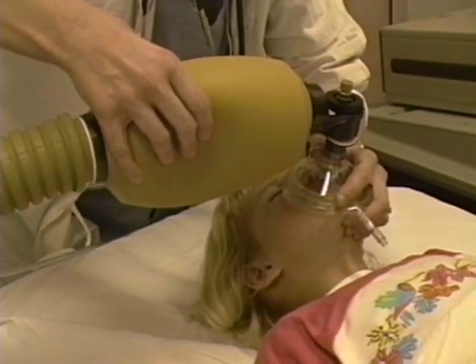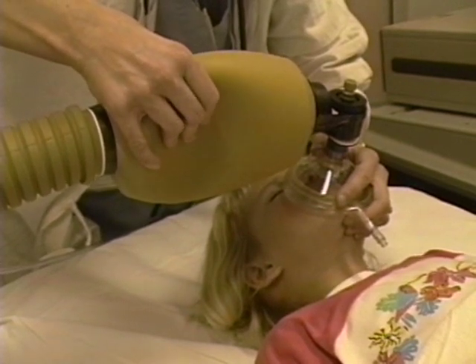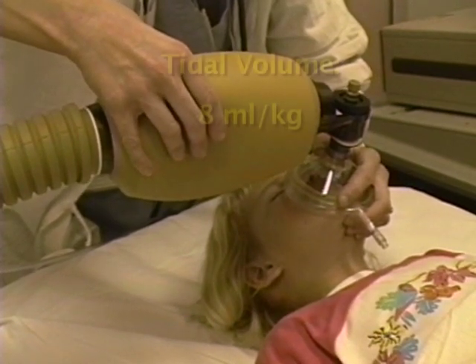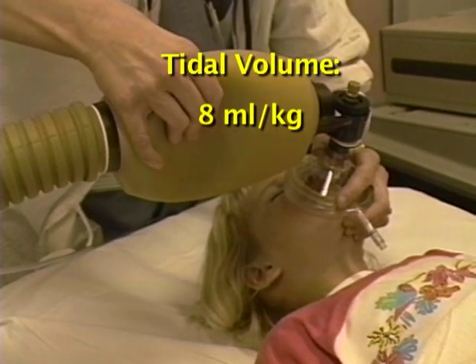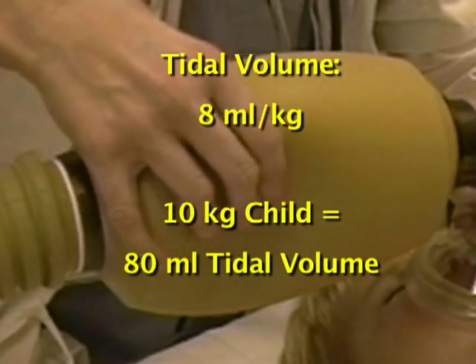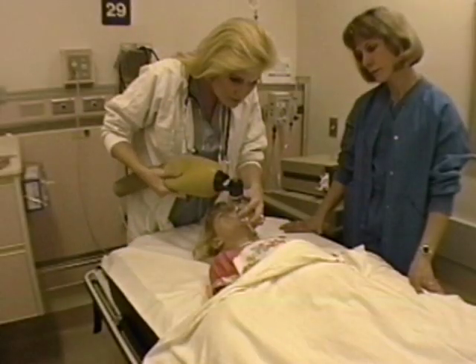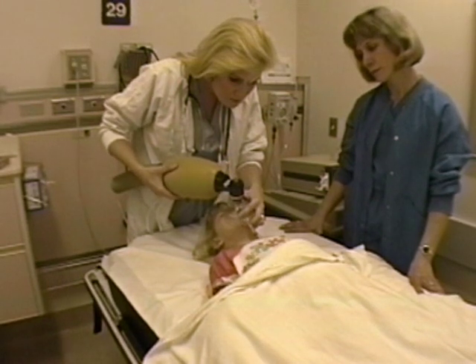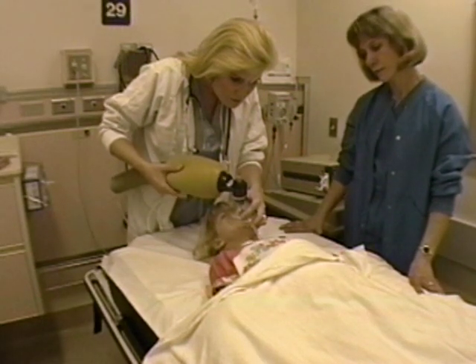To ventilate, squeeze the bag. The chest should rise with each breath. Both children and adults have a tidal volume of about 8 milliliters per kilogram of body weight. A 10-kilogram child has an 80 milliliter tidal volume. Watch the chest rise as you squeeze the bag to gauge the volume of breath you're delivering and the resistance to ventilation. Pediatric inflation pressures are lower.